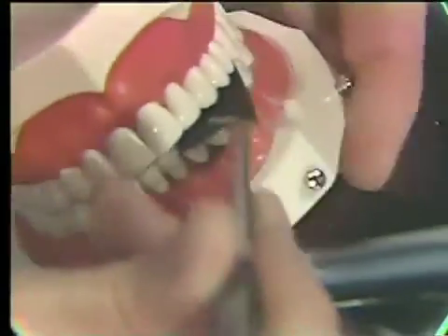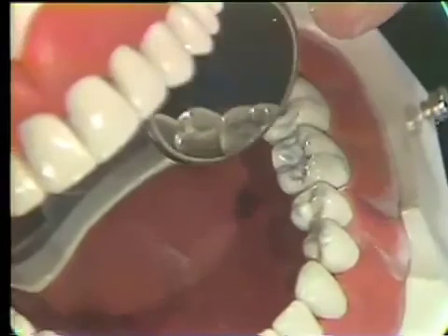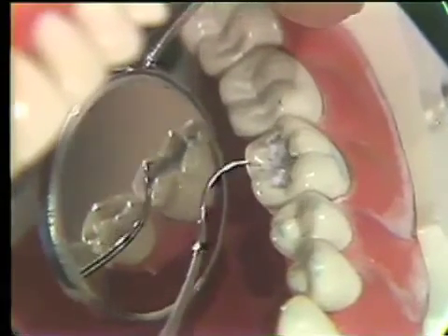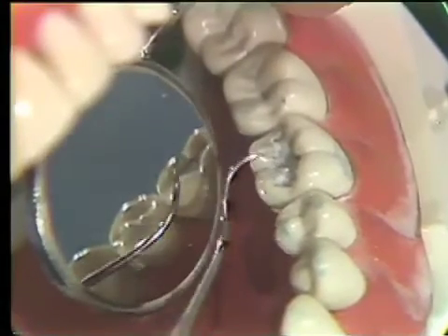We have a little time left, so let me go over some other details. One of the things we forgot to do — which is very important — is to check the occlusion on any restorations that have an occlusal surface involved. To do this we'll use articulating paper. Generally we place the articulating paper right over the tooth, close it, and tap several times. Then we check for occlusion contact areas on the tooth. With a small class one like this we wouldn't expect much occlusion area; we wouldn't want a large blue spot. If we picked up a large blue area on the tooth itself, that would indicate we carved high and we'd want to reduce it just a little bit.